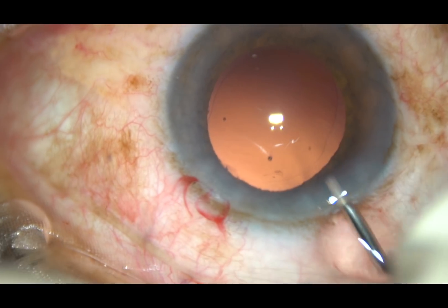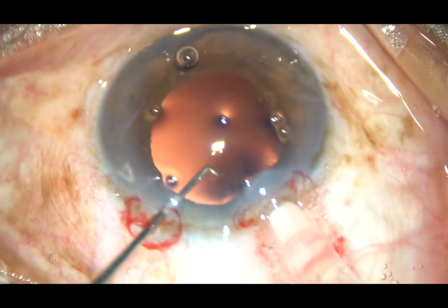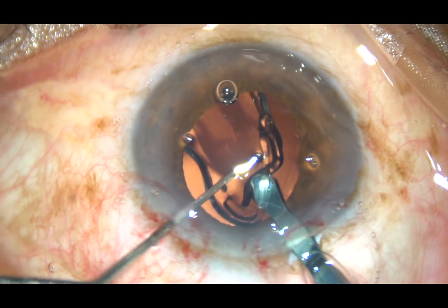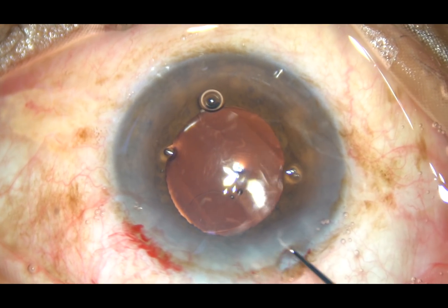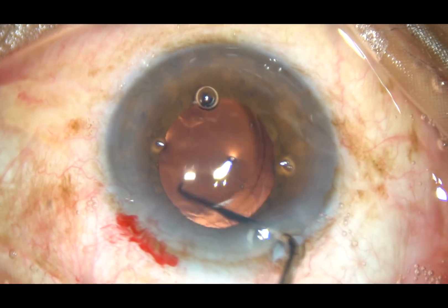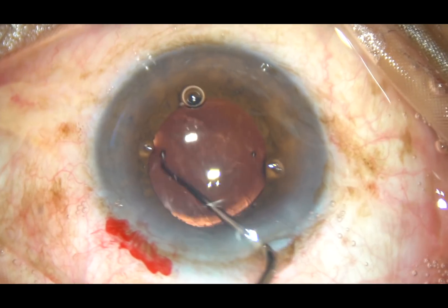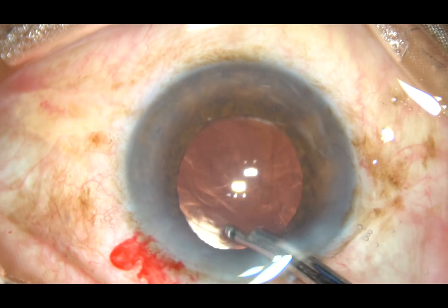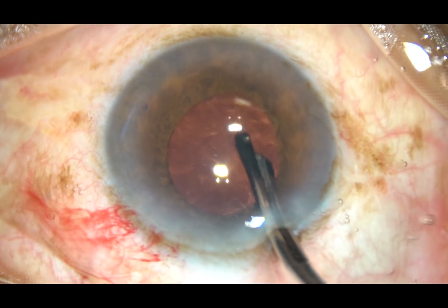Now viscoelastic substance is injected, because if I inject viscoelastic substance, the pupil will dilate and I will be able to see the anterior capsular rim, and I will be able to make sure that the lens goes in the capsular bag. Yes, the lens has gone in the capsular bag, and I am removing the viscoelastic substance now.